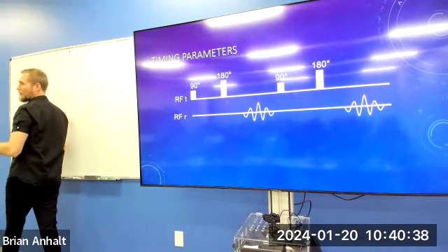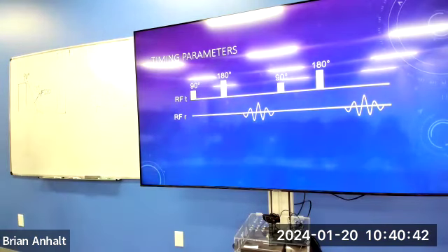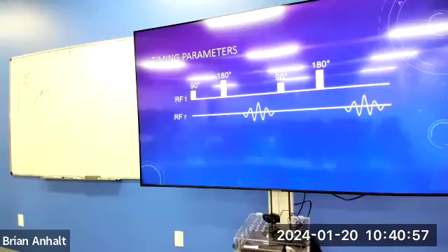We don't measure the FID. In MRI, we have to collect an echo. The physics behind image reconstruction, we want to see the echo come into phase and then back out of phase. We want symmetry there. That has to do with the way we're reconstructing essentially waveform data into an image. But we never sample the FID to create an image, ever.